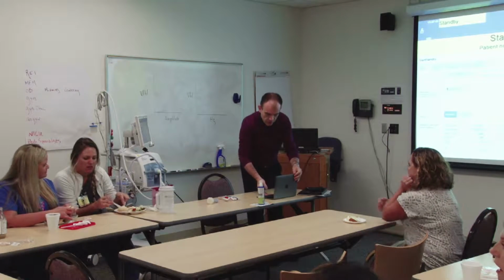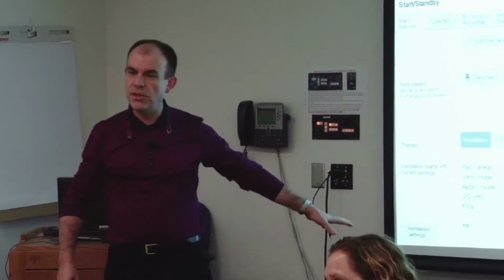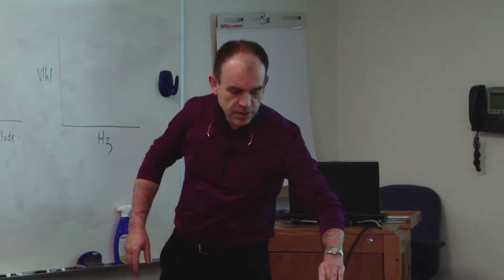Everybody? Good. Since we tried to project the ventilator screen here so that it's easier, I just wanted to show you a couple of slides, but we can just check them out here.